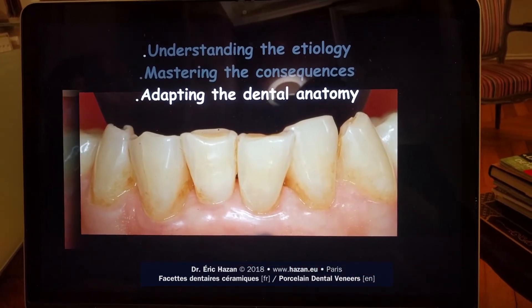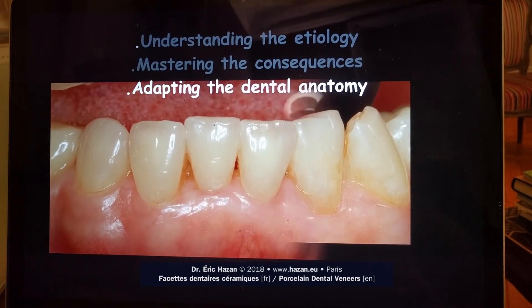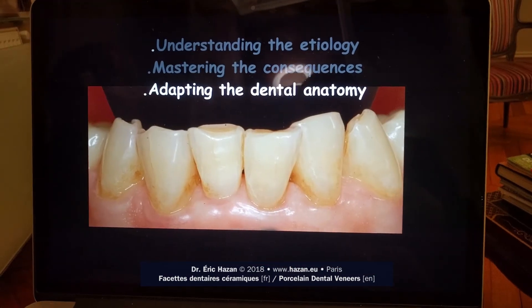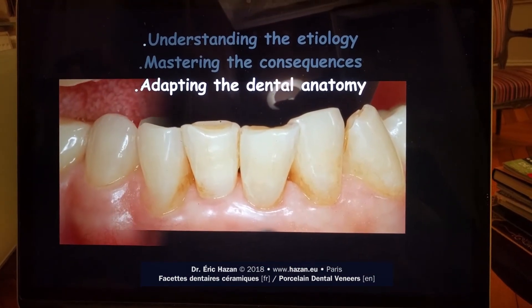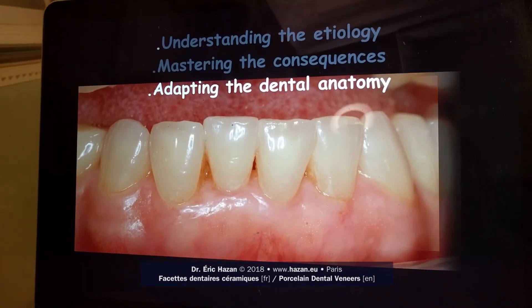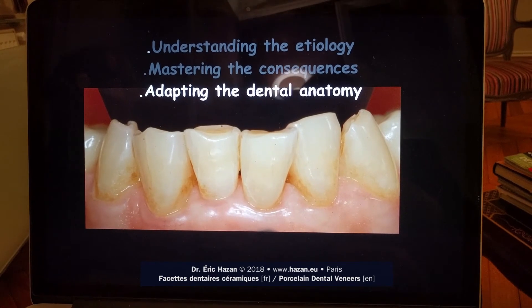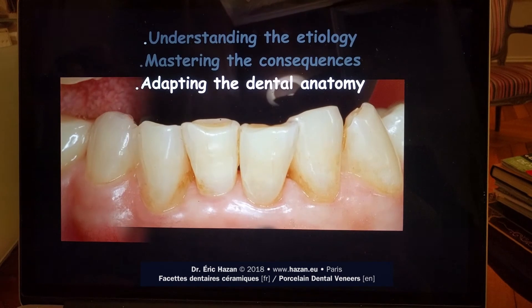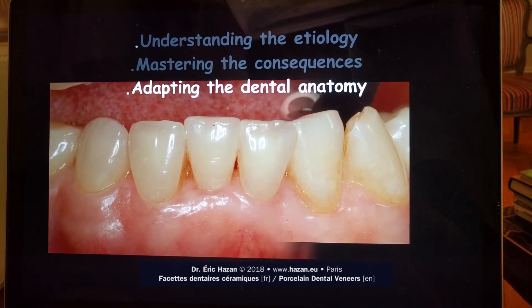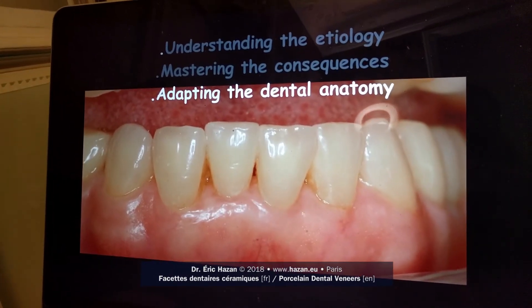This is before and this is after the placement of the veneers. Right away we see younger-looking teeth, because we have restored the profile on the border of the upper part of the teeth — the surface that was worn off due to the para-functional habit. Just by restoring the proper shape and anatomy, the teeth look much younger. And not only is it good for aesthetics, but it also restores function by giving back to these teeth their proper anatomy.